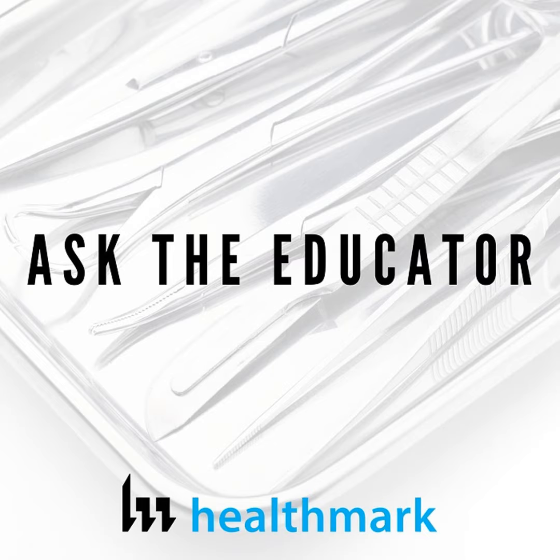But you won't know that by just having a laundry list of things that you've not categorized and you can't dissect. It may be it's your second shift staff, you know. It may be that you don't have supervision on your evening shift, right? Your midnights, and that's where your problems are coming from. So you really got to be able to use the data to drill down to determine what the problem is. Once you determine what the problem is, then you can solve it.